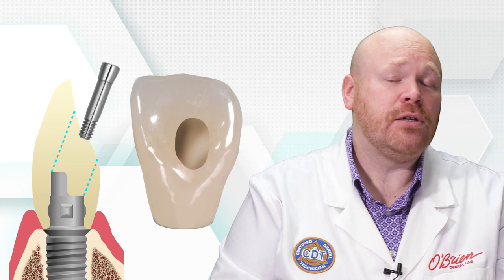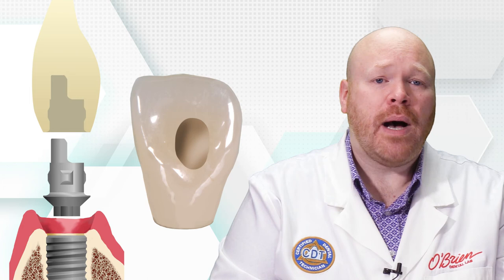The crowns will also require a larger access hole, which is necessary to allow clearance for the screw as it's tilted during insertion. A smaller access hole is possible, but if designed that way, the screw will be captive inside the crown once it has been cemented to that base. You would still be able to tighten and loosen the screw, but in order to replace the screw, the crown would have to be separated from the abutment.